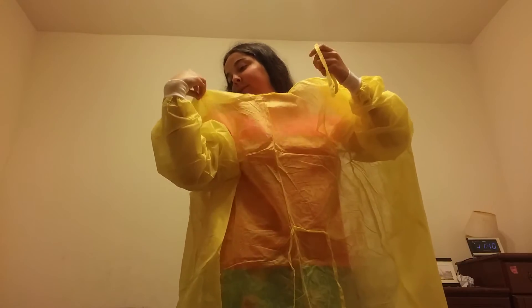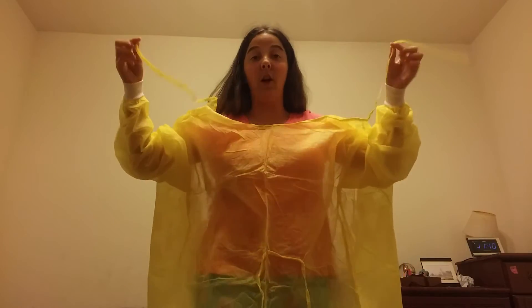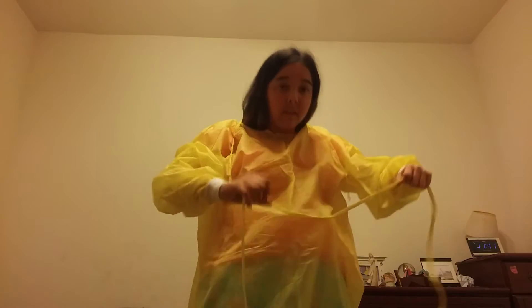In the back there are ties — you tie them in the back, and you also have ties up in front that you tie in the back as well. Now hold on, still got to do this.